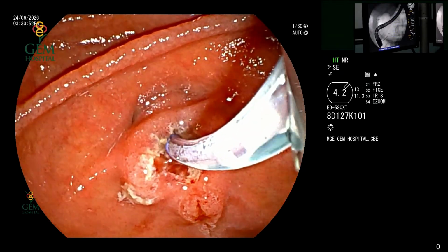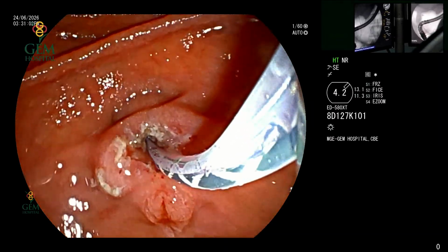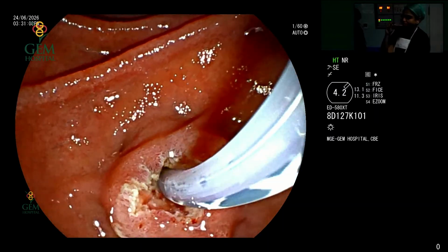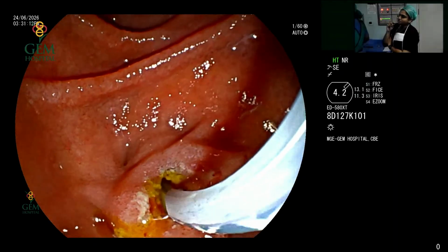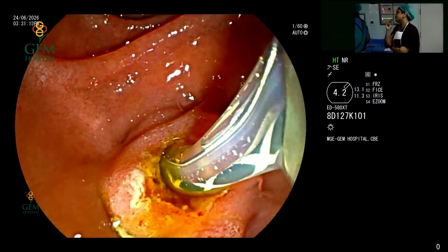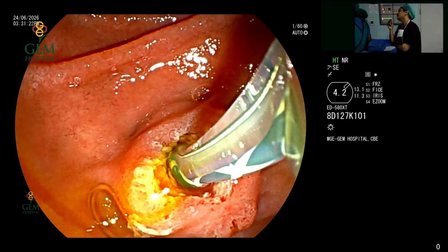You can focus on the cholangiogram now. We can see the CM image now, as we have already mentioned. Now the wire has taken more of a vertical route. We can see in the cholangiogram image that our guide wire has entered the biliary system, which is supported by the evidence of the fresh flow of bile that we see in the scope image.